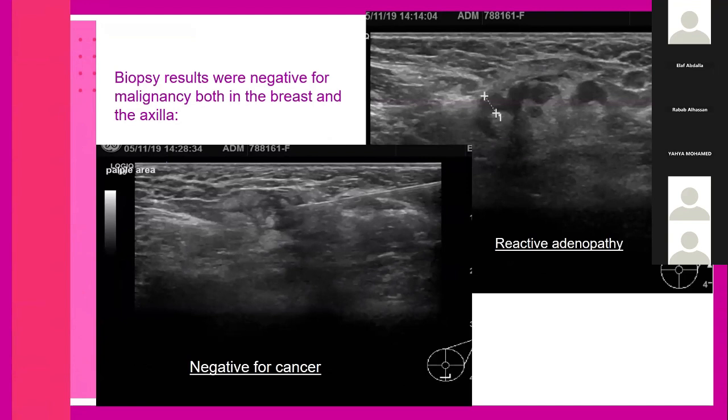They recommended biopsy in spite of the benign reporting. When rediscussed in the MDT, we recommended a biopsy of that region and of the lymph node. The biopsies of both were negative.